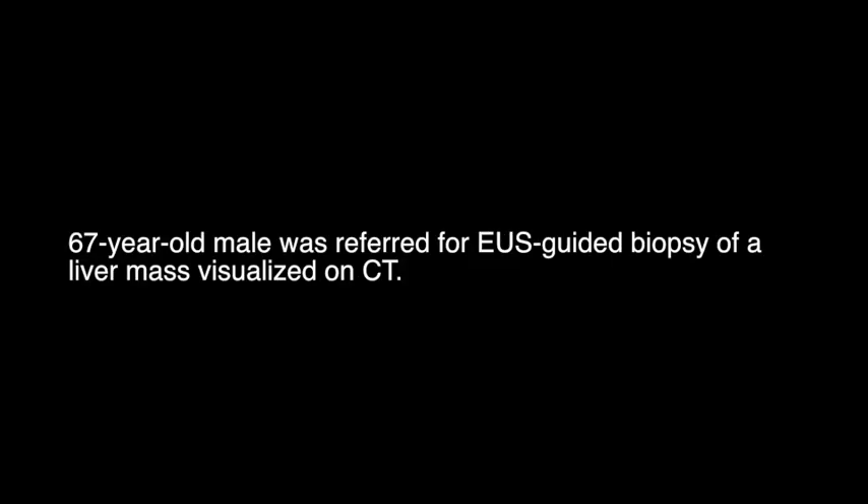In this video we'll be demonstrating the technique of EUS guided liver biopsy. A 67 year old male was referred for EUS guided biopsy of a liver mass visualized on CT scan.